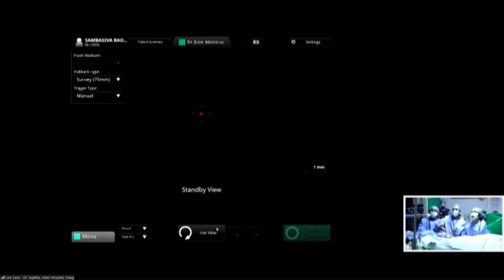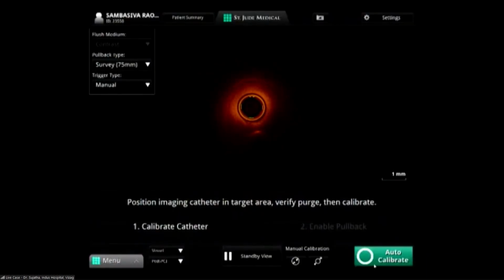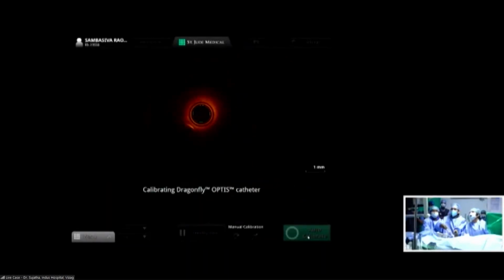Yeah, I think imaging definitely helps us to make sure that we are getting the appropriate minimal stent area. Yes, sir. We want to see that and we want to see the circumflex. I have not taken any injections. Yes, this is another important point. We can avoid taking direct injection because when you're doing the OCT itself, you get a good angiographic injection also. That saves some contrast. We have a tendency to check immediately, but when you're planning OCT, you can as well do it.